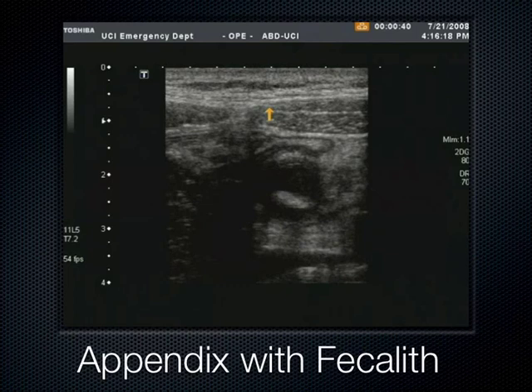There are risks that you can do to patients with ultrasound, such as dislodging a DVT. That does frighten me, but compressing an appendix, I don't think there's enough extrinsic pressure that you could perforate it. I think really the true perforation comes from the inside getting ready to make it pop. Yeah, we're pushing a lot of pressure, and maybe I oversold that too much. We're not pushing so hard that we're causing a very local part of it to perforate. I mean, we're pushing enough just to kind of get the muscle bellies to come together.